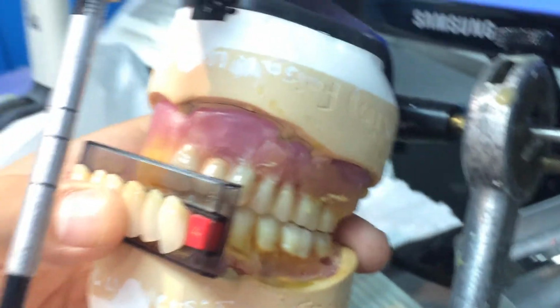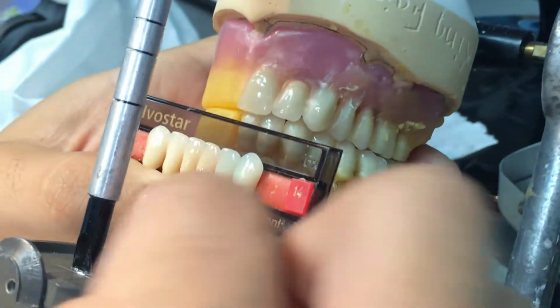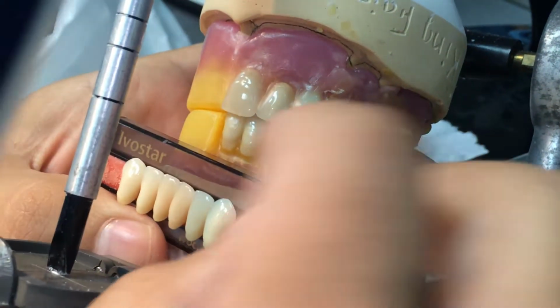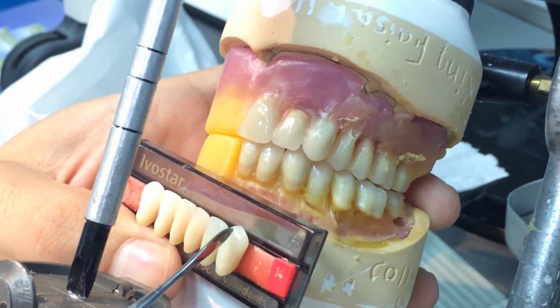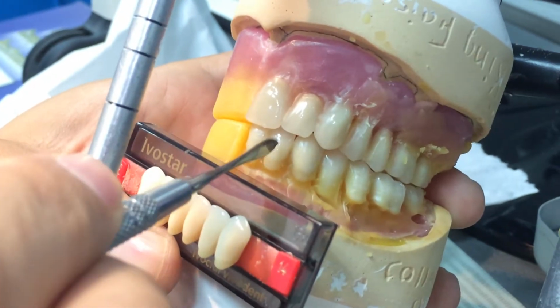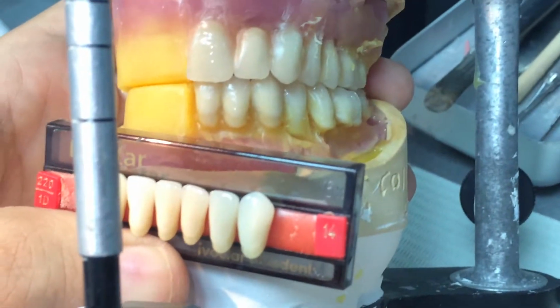You got it? Also the lower anterior is going to be like this. You'll take the canine here and set it here, down. Let's make it small. You'll take this canine, it goes here. Lateral goes here. Central goes here. So, on the same side of the set.